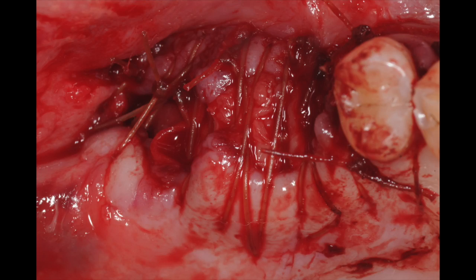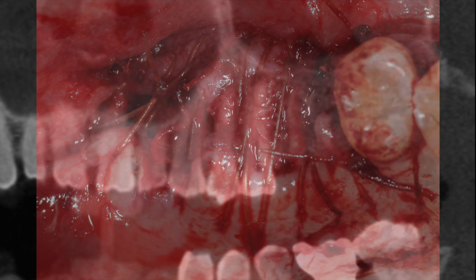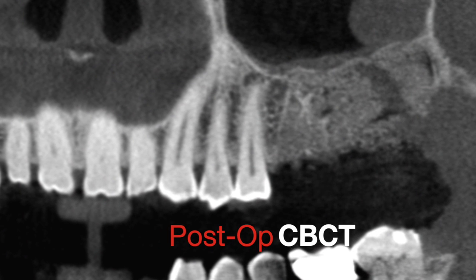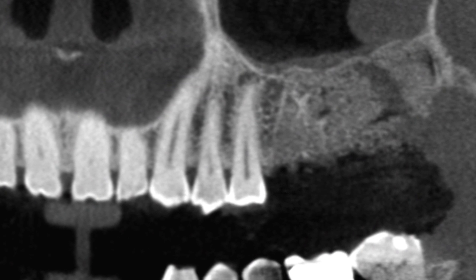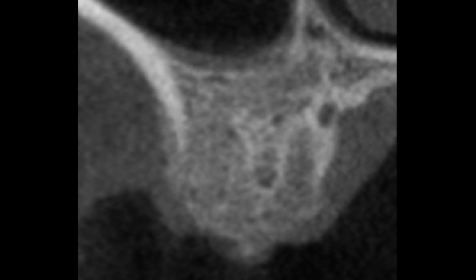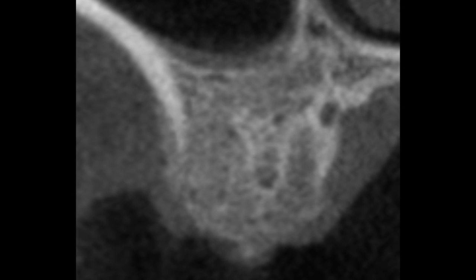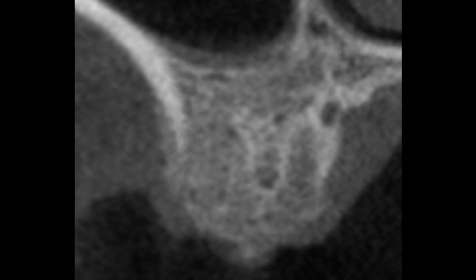Depending on the amount and quality of the soft tissue, a primary closure can be achieved, although not absolutely necessary. I've found that with the addition of the PRGF membrane, we can stimulate soft tissue maturation and achieve granulation and secondary intention relatively well. A post-operative CBCT is recommended to make sure there are no voids or areas of possible residual cysts left. Here we can appreciate that complete removal of the cyst has been achieved and the bone is uniformly packed into all areas.